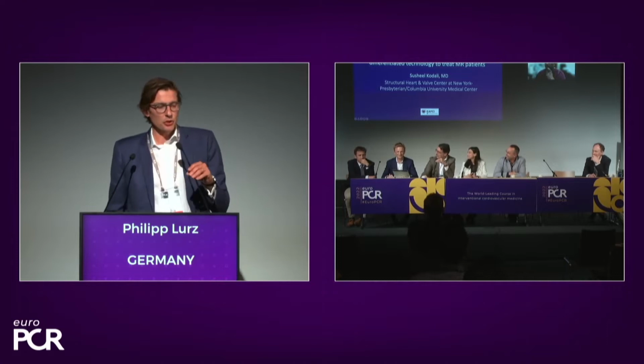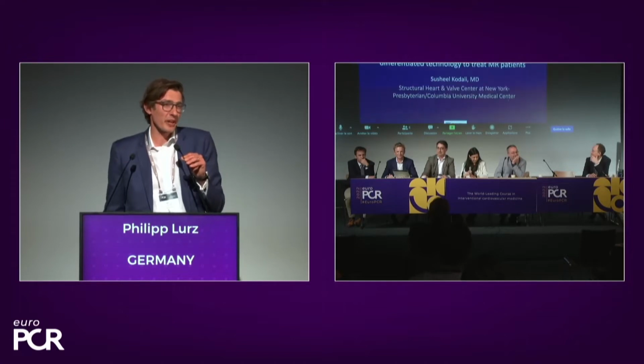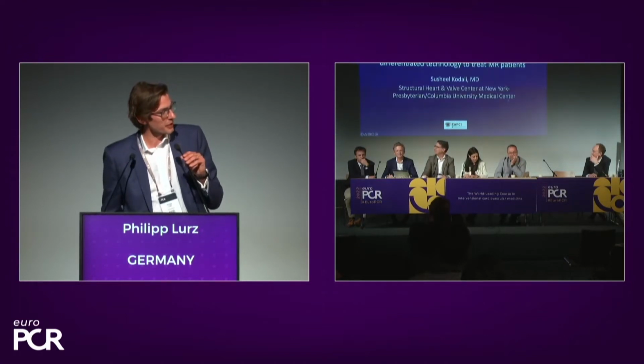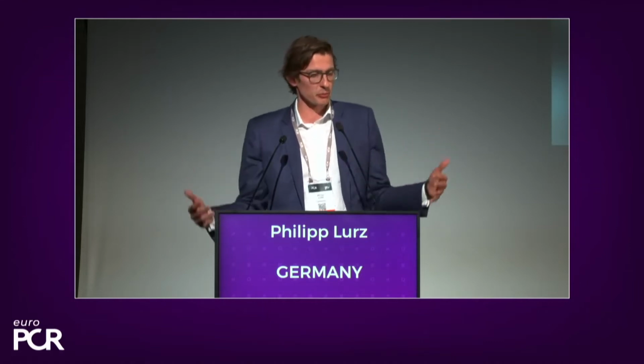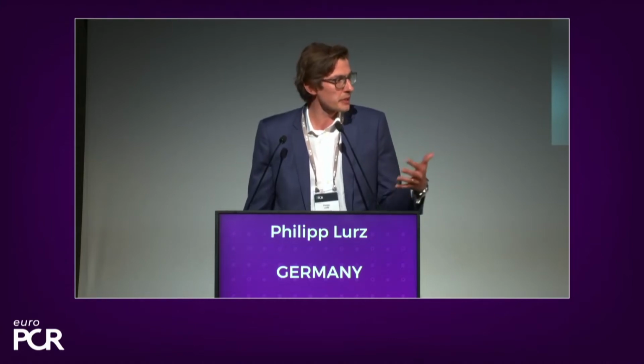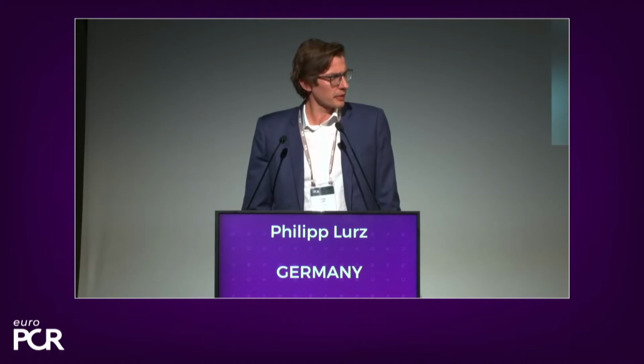Okay. I could share more details with you, but first we will see more details during the case, and secondly we had to make a decision with the information I presented to you, so it was also not any clearer for us. Then you could argue whether you should bring the patient back, do another TEE, bring everyone in the same room, or use the image we had. And I do agree we had some discussions about what the exact pathology is, but obviously it was degenerative, it was commissural, it was medial, the risk was high for surgery, and this is why we were relatively optimistic, or at least we thought it's a good idea to try to treat it with a PASCAL implantation.